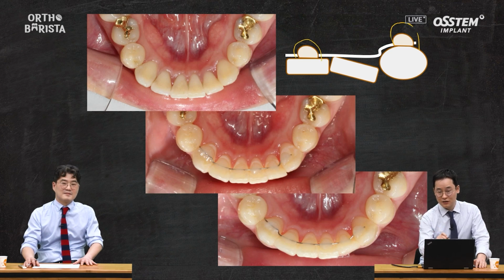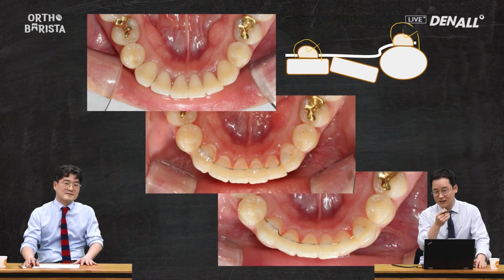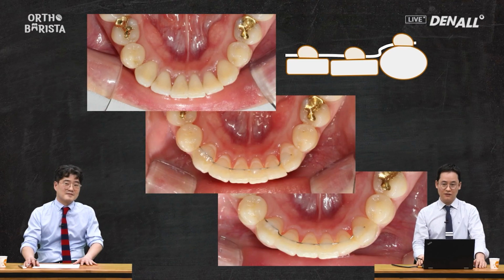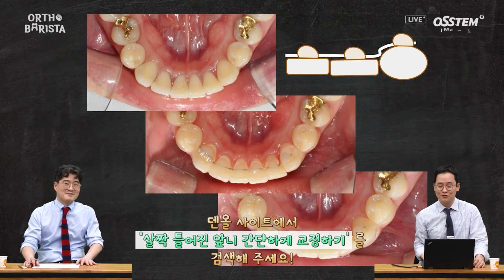It's important to understand this step clearly. The resin essentially acts as a bracket in this scenario. As the Vaseline washes off, the wire is allowed to move back and forth. Once the wire is in position, you bond it securely with the resin, which enables a level of adjustment. So, what does this mean? Well, watching that video might help clarify things further.